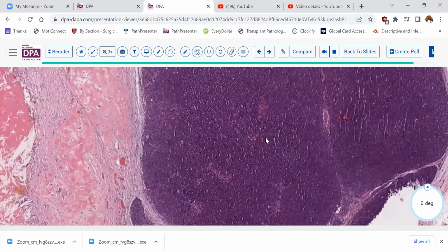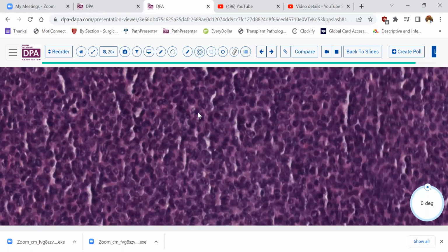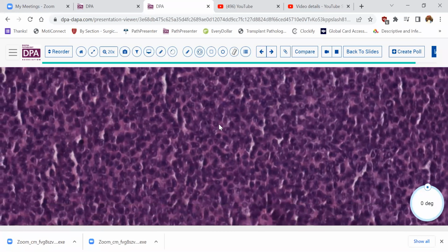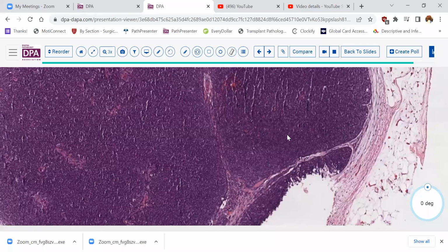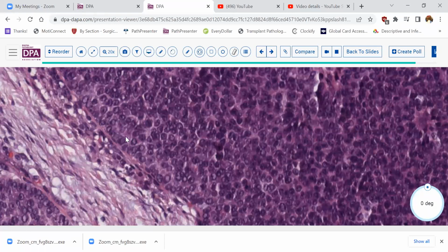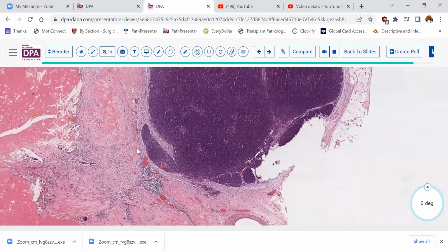I'll just take a look here briefly at the classical adult type granulosa cell tumor. As you can see, it's a very diffuse pattern of growth, small, slightly open nuclei. Maybe this is a thicker section than usual, so we're not seeing all of the nuclear grooves and other details that would be characteristic of granulosa cell tumor. But there is a degree of diffuse architecture and maybe a little clustering that would be compatible with that. Oh, maybe here we can see a few grooves in this area as well. So take my word for it, this is adult granulosa cell tumor.